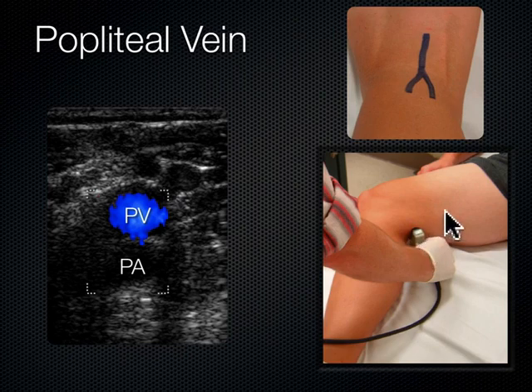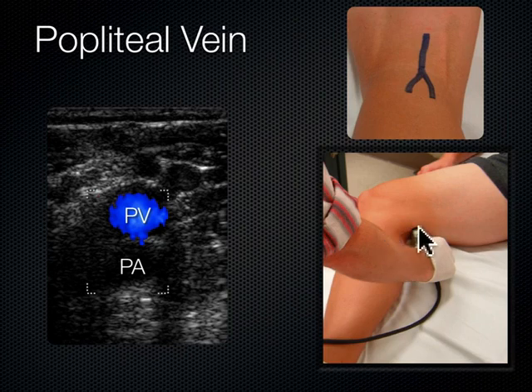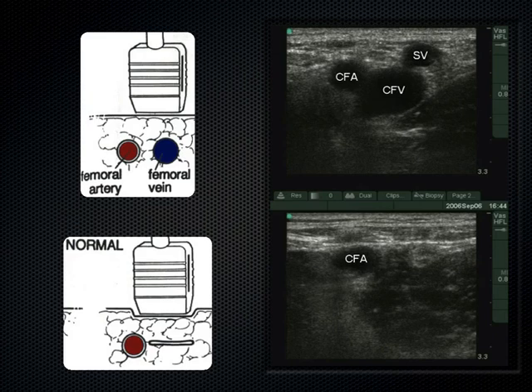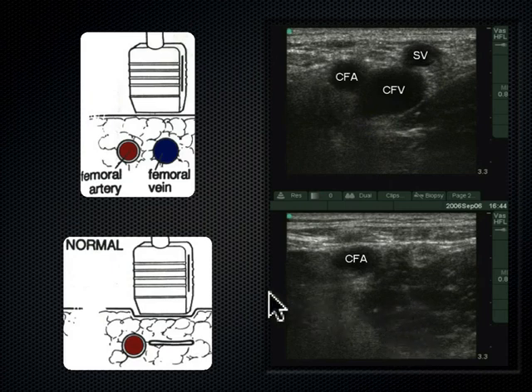This is my right hand holding the transducer. The patient's leg is externally rotated and their knee is flexed — in that position I can get good access to their popliteal fossa. I take my other hand on the patient's knee and push these two things together. In somebody with normal body habitus it's straightforward, but with larger legs or very muscular legs with prominent biceps tendons, you'll need to use both hands and really squeeze to get those vessels to coapt. Here: without compression above, with compression below. The saphenous vein joins into the common femoral vein, proximal. The veins totally collapse — no blood clot.